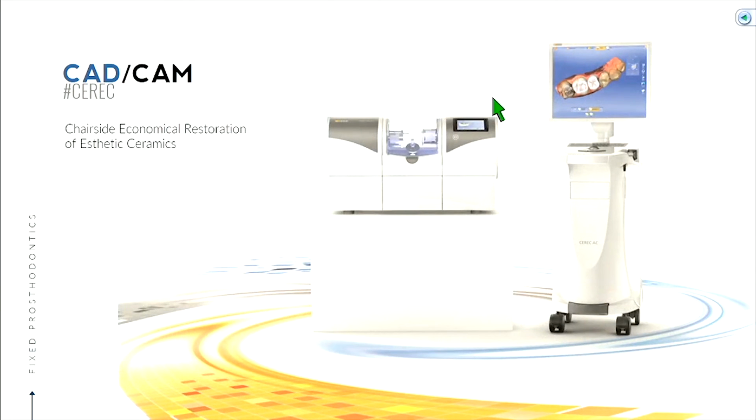So we are going to stick with the CEREC system because that's kind of what we started with, and that's what we have in our clinic, and they've been good to us in terms of donating a bunch of equipment. So CEREC actually stands for Chairside Economical Restoration of Aesthetic Ceramics.